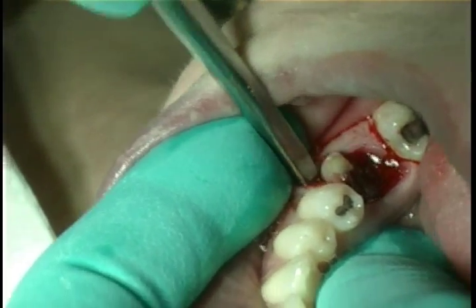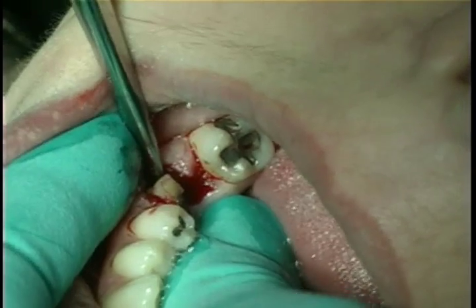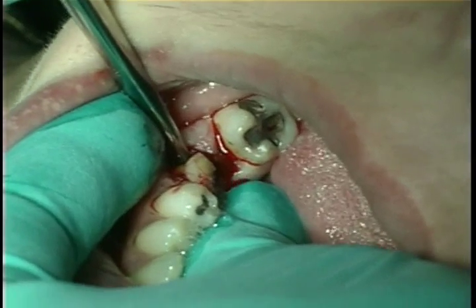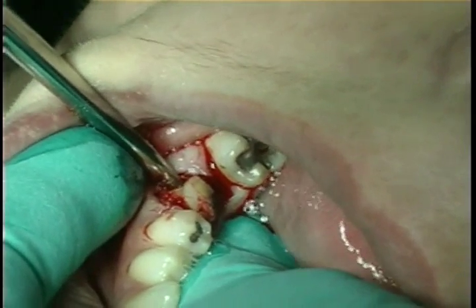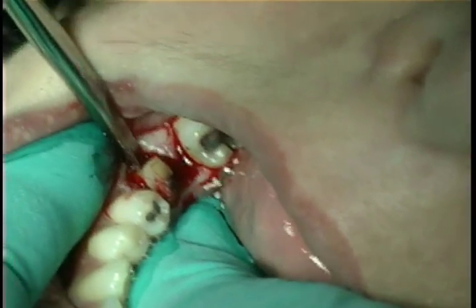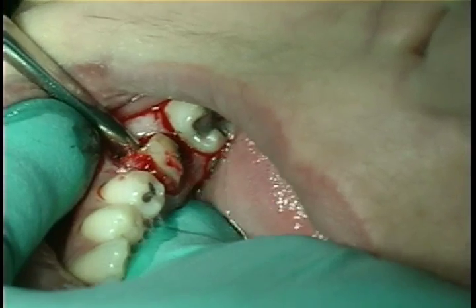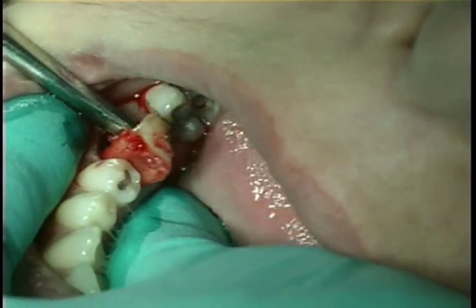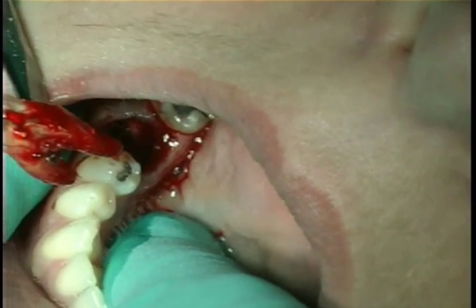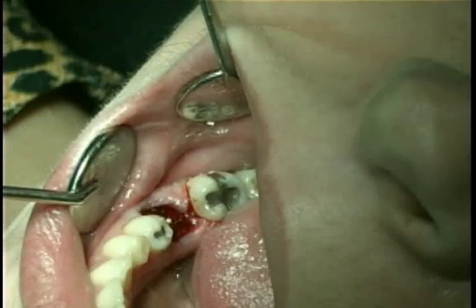It is a little unusual that buccal elevation in this case is so successful. The root complex is seen here in one piece and the extraction is complete.